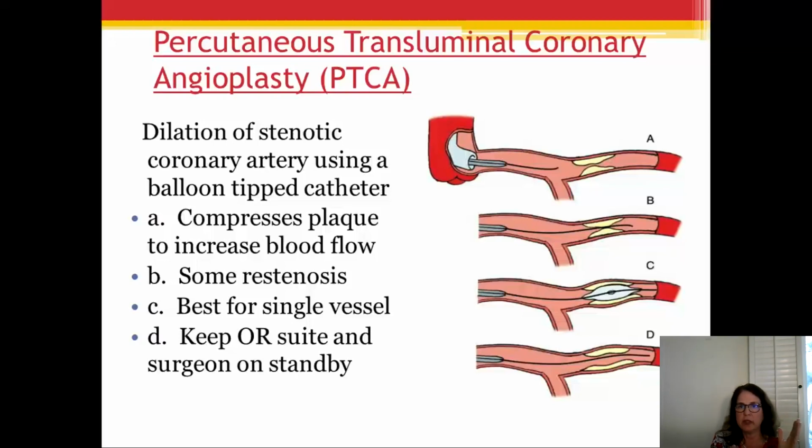You can imagine the first guy that did this, everybody thought he was out of his mind. It's just going to blow up. And we'd always have the open heart surgeon standing there pacing the hallway, assuming the chest was going to explode. And it's surprising how well people do, really. Some restenose afterwards. It's literally best for single vessel disease, something straightforward they can get to, not some contorted thing. Again, the OR suite is on standby, surgeons on standby, you have to have somebody around in case this doesn't go well. The problem is restenosis.